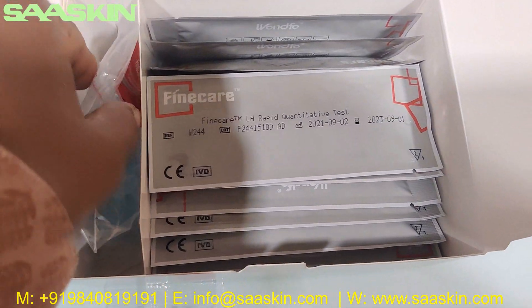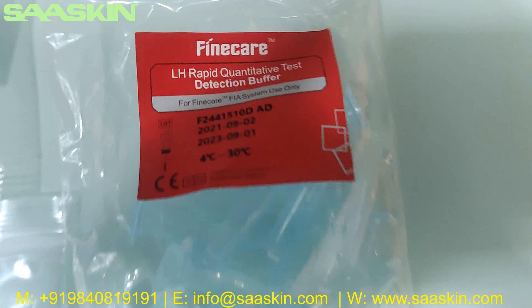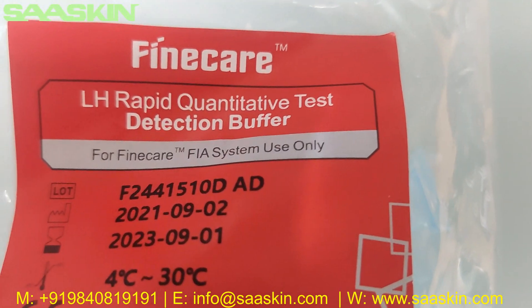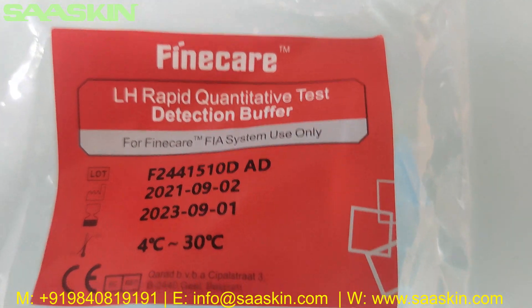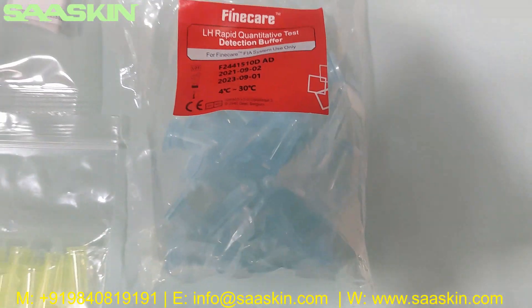Here you can see 25 dilution buffers, individually packed. Each one says 'LH Rapid quantitative test dilution buffer for Finecare FIA system.' It has 2 years of validity and can be stored at room temperature.